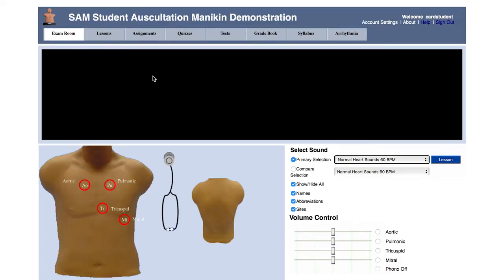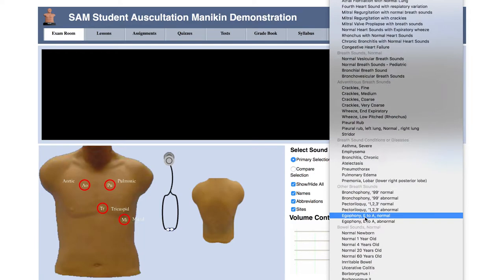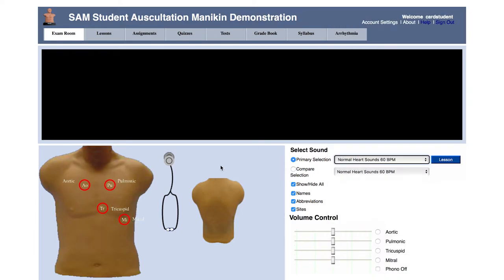With the SAM Online interface, we've made everything highly efficient so that no time is wasted searching for the tools you need. At the menu tab up top, we start with the exam room. This is where students will be able to listen to over 80 cardiac, respiratory, and bowel sounds, as well as see the corresponding phonocardiogram and EKG waveforms.